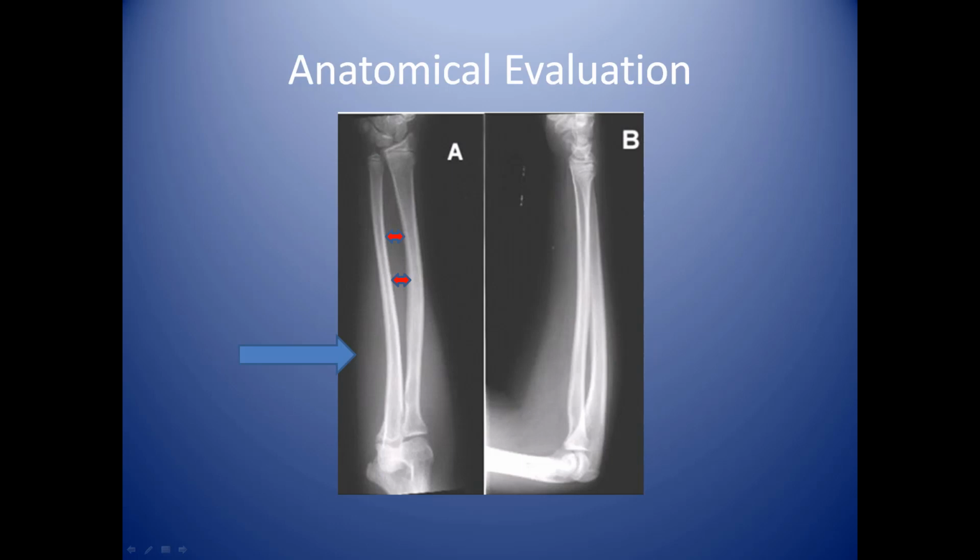First, with an AP wrist that's included slightly here, you can see some of the carpals up here, the bones that are kind of spread out, and you see the radius off to one side and the ulna off to the other, so you can see this is a clear AP wrist. Now we can identify that at least this side of the image has been positioned appropriately.